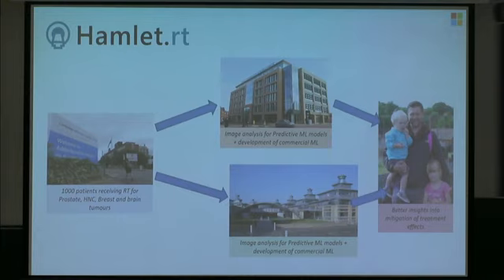So this is a patient of ours. He's a chap with a glioblastoma who sadly died earlier this year. And we want to be able to, there's a couple of things here. So he's holding on to his kids. He's been out playing with them. And you'll also notice that he's got a good head of hair. Simple things, right? Now, in order to do that, we had to customize his radiotherapy in order to avoid damage to the hippocampus and to certain areas that are critical in neurocognitive function, because that was important to him.